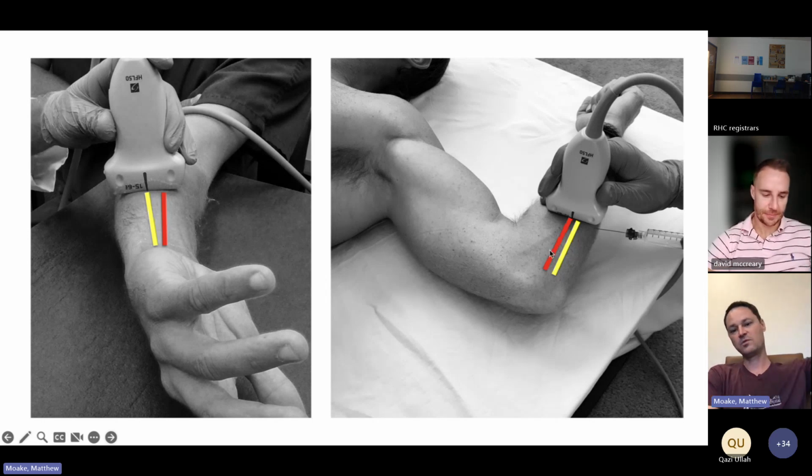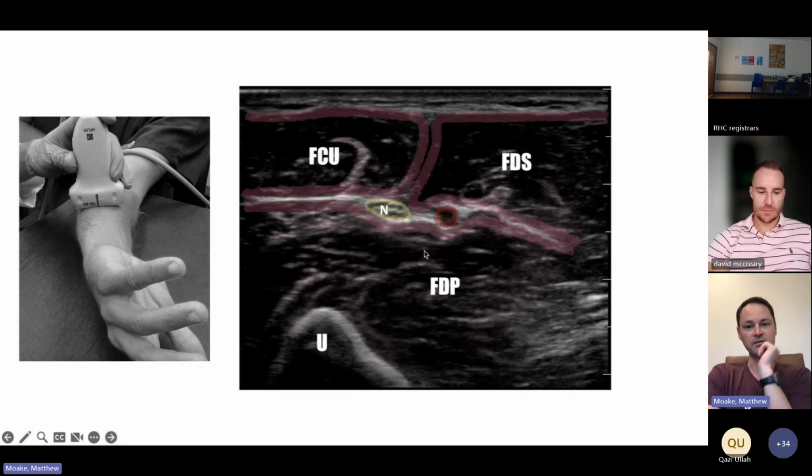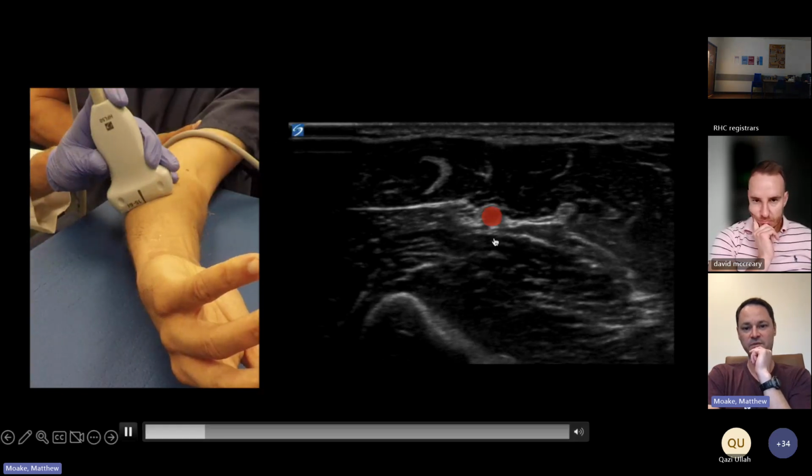Or if you have your patient raise their arm up, like shown on the screen, that'll give a much more natural approach to the nerve. Again, sitting in that fascial plane with the vessel, it's going to be ulnar to the vessel itself. So vessel, nerve sitting there. I do find the ulnar is pretty easy to find most of the time. Again, fanning along, we've got our vessel, our nerve, and the bony structure there.